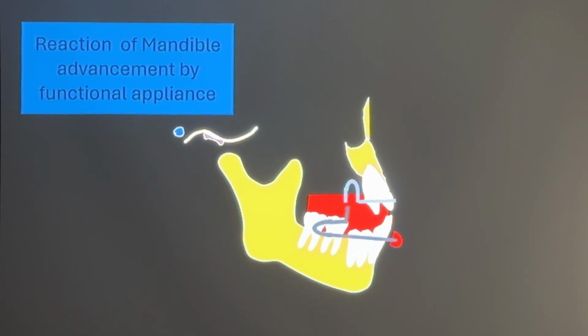So practice it after the lecture. Advance or retract, control it. And sometimes for this wire, I need it going up, or sometimes going down. You can control that also, okay? So control this wire around this area according to your decision.